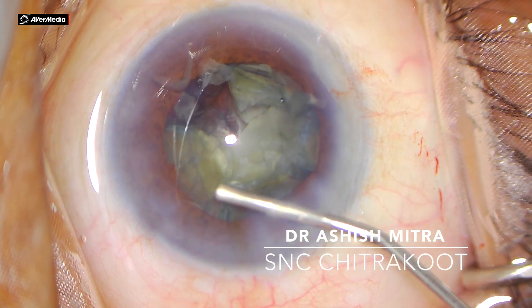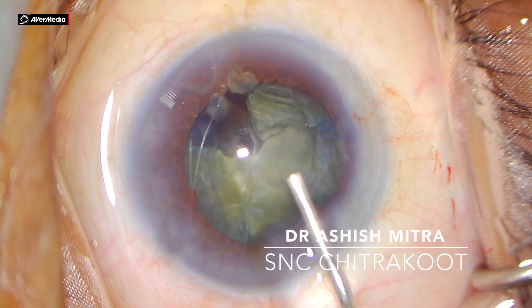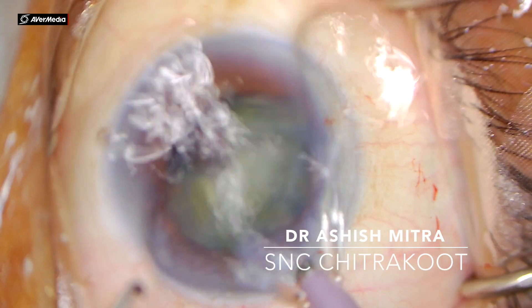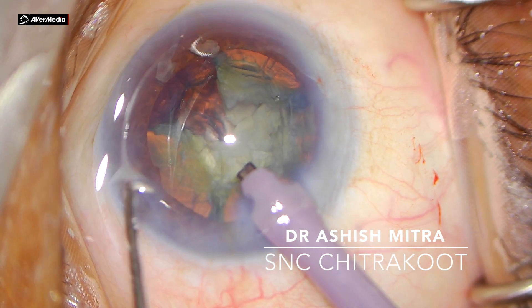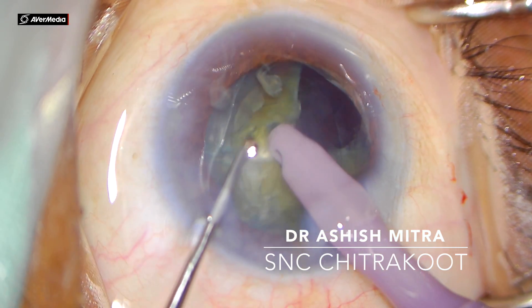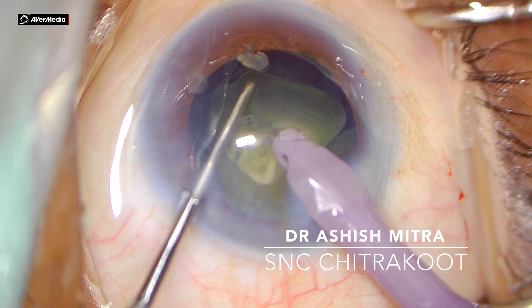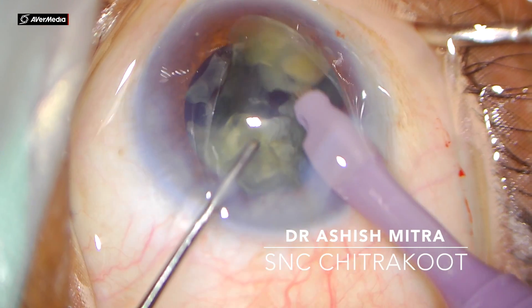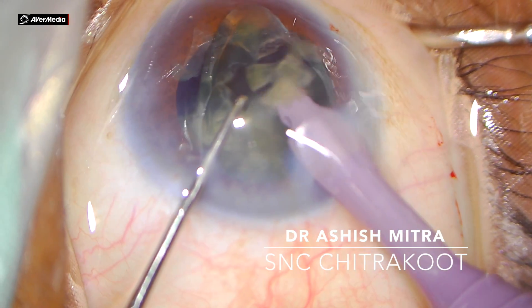At this point there was some iris coming from the side port, so I injected visco and reposited the iris back in place. After injecting visco again, I went inside with the phaco probe and dialed my nucleus with the help of the chopper. This piece is again taken out and emulsified with the help of the phaco probe itself.